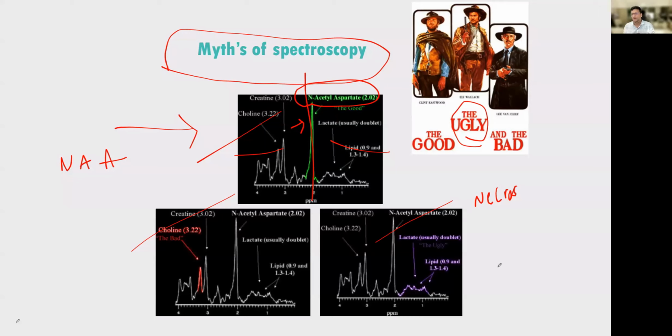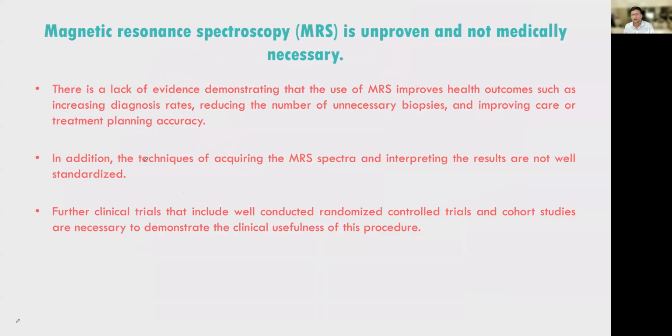Okay, for example, I will give you a beautiful example. In Canavan's disease and Pelizaeus-Merzbacher disease, there will be over elevation of NAA. So you've seen, NAA peak means if there is too much of NAA, you would be telling very good brain, excellent brain. No, it is a pathology. So please leave the concept of good metabolite, bad metabolite, and ugly metabolite. This is a myth which you have been following all these days. Again and again, I don't want to repeat.